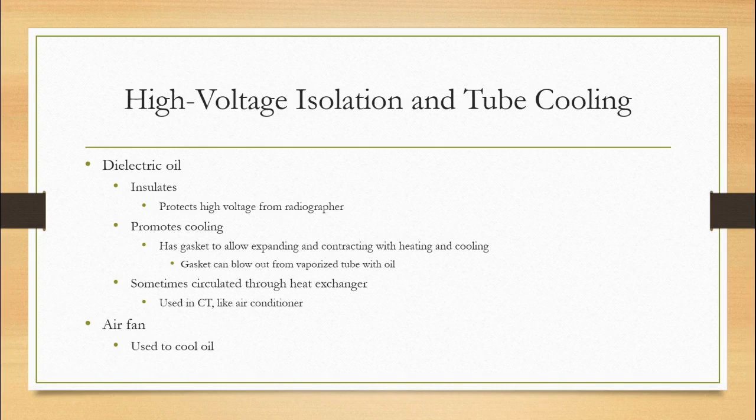So what happens is sometimes when the tube arcs, it can crack the glass or the oil, and the oil can drip onto the really hot anode and cause an explosion. These gaskets will blow out. Very dangerous situation. Thank God it's not common. I've never had an explosion.